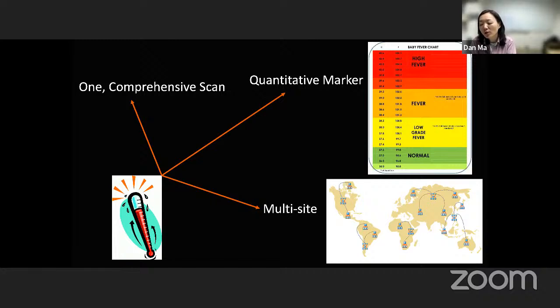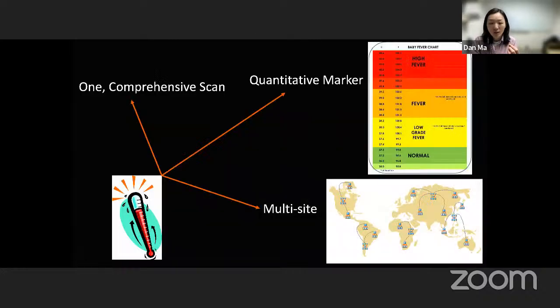Another thing is that we also prospectively, on the sequence side, designed motion detection and correction technology. So basically, during the MR fingerprinting scan, we can detect or monitor the motion and use that motion information to correct for the k-space. So that the resulting data will be less affected by the motion. So there are two ways. So beyond just quantitative MR data, you're also able to do artifact correction, correct? Yeah, motion correction. Just motion?